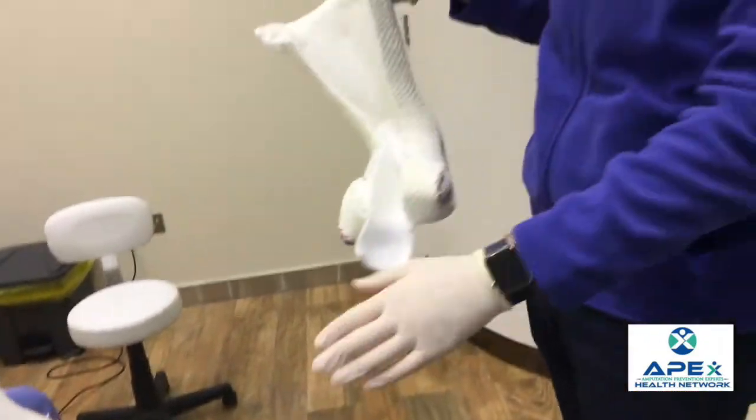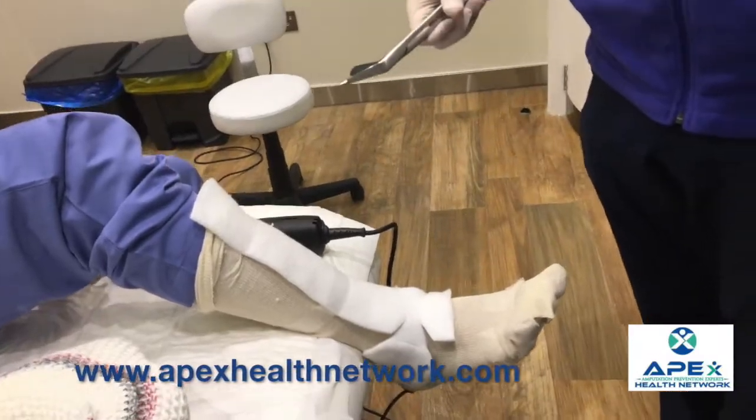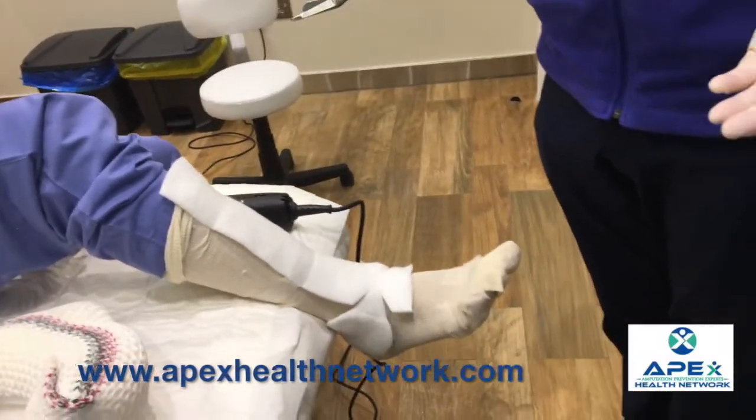Now the cast is removed. What you would do then is just use the scissors to remove the rest of the cast padding and the stockinette, and treat the ulcer.